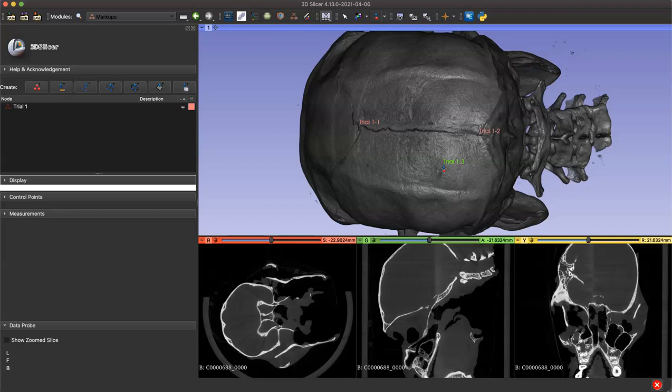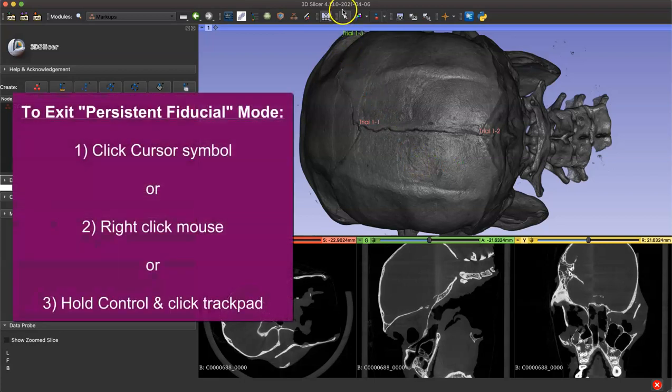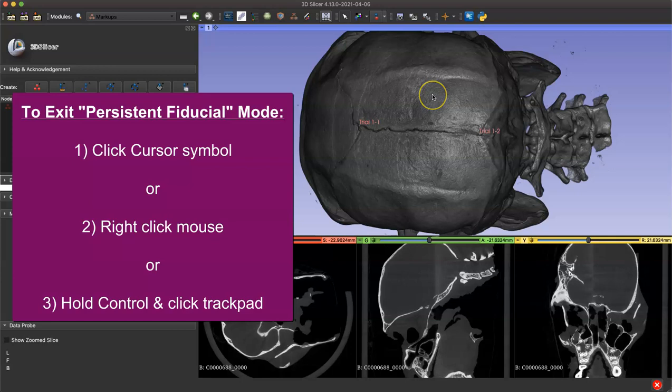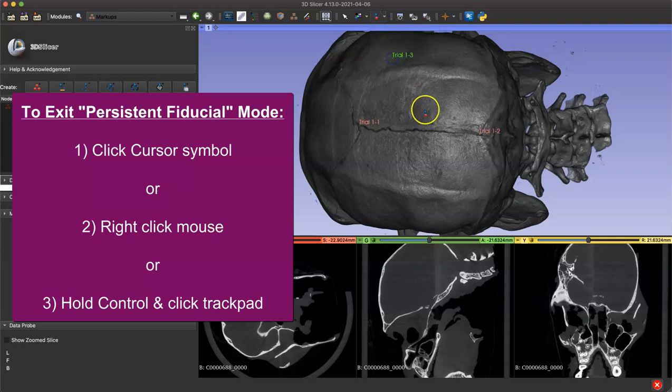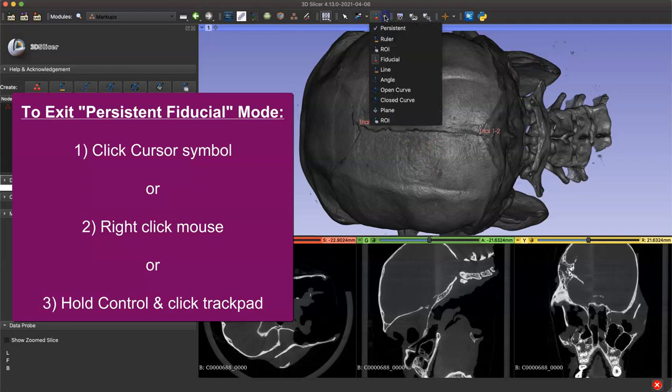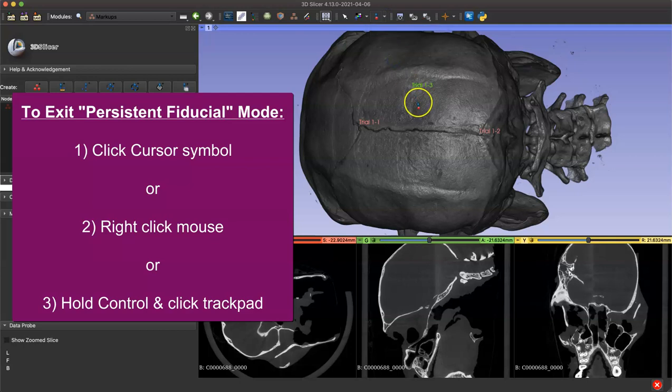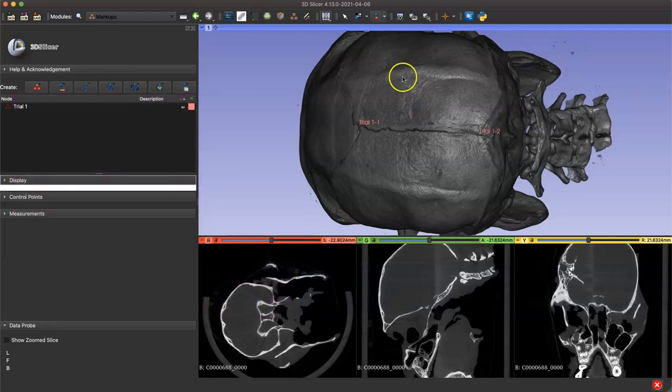Once you're done placing fiducial points, there are three ways to get out of this persistent fiducial mode. You can click this symbol. Notice when I click now I'm not putting down any new fiducial points, and then when I click fiducial again it's going to say trial one dash three, so I'm ready to take my third landmark in this group that we call a node. You can also right click to get out of this mode or hold down control and click your trackpad.